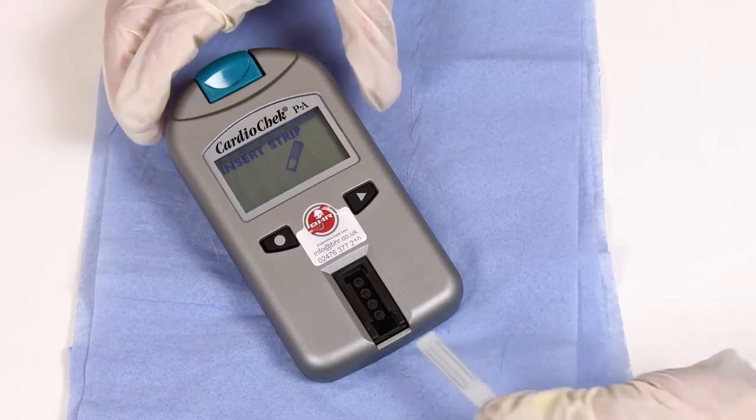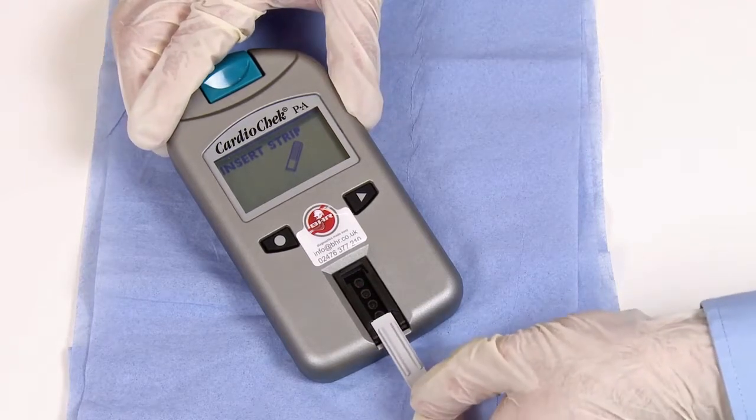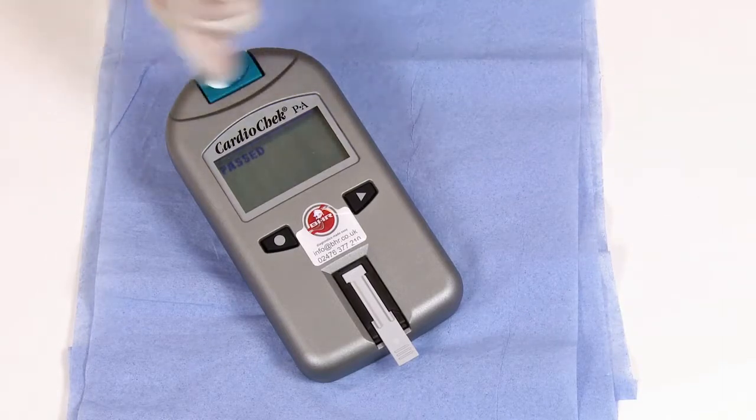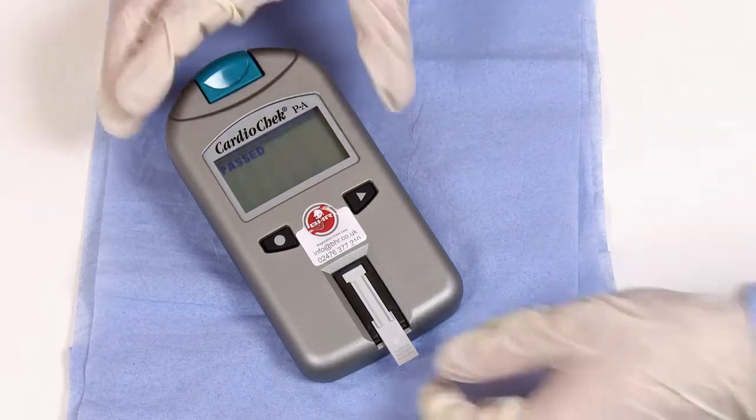The analyzer will ask you to insert strip. Take your grey check strip and insert it into the analyzer the same way you would a normal test strip. The screen will then change to testing and give you either a pass or fail result. As you can see, this CardioCheck has passed its daily check and is ready for patient testing.